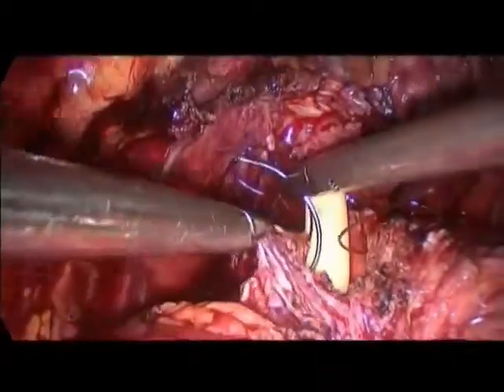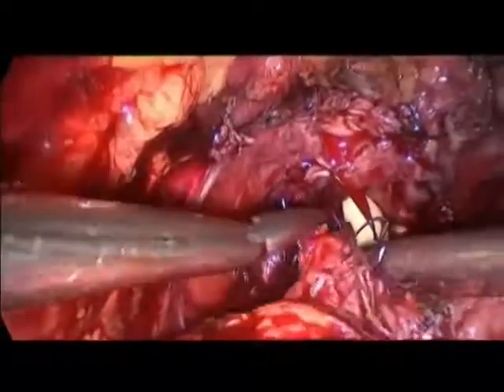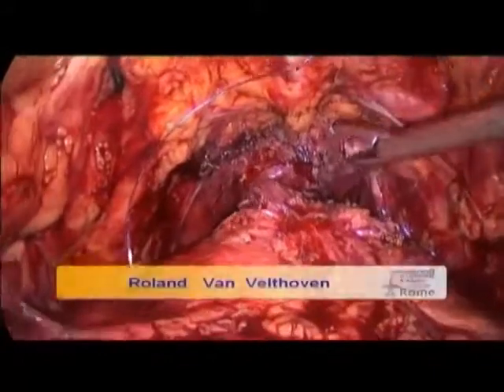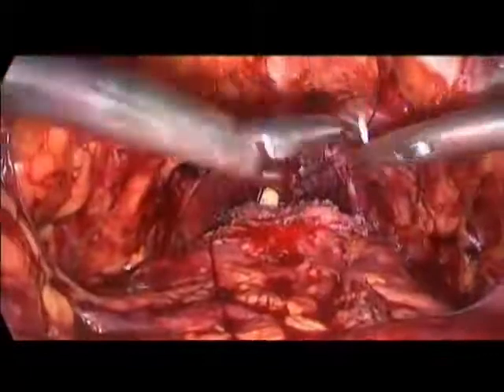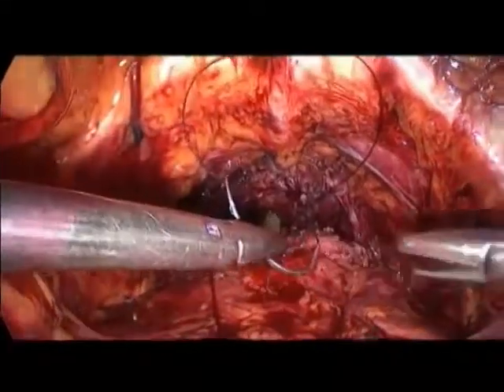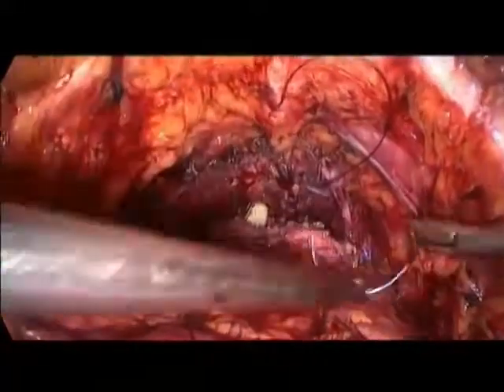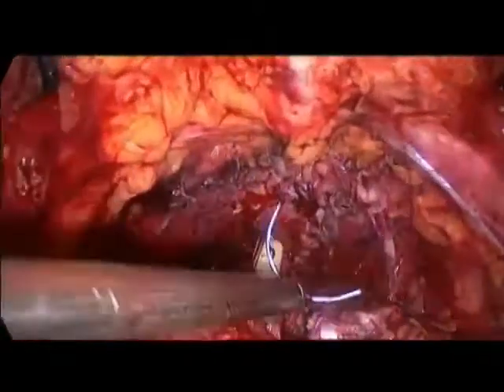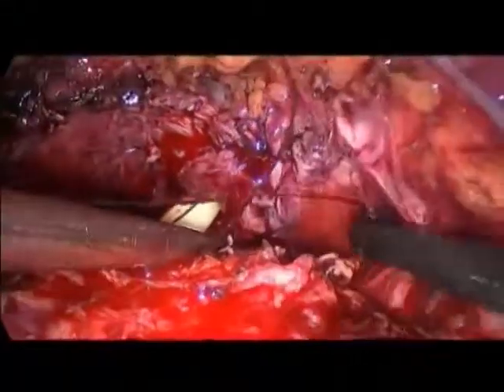And we had some troubleshooting problems with my first suture, so that I had to start from the very beginning again, but this was not a problem. And as you have seen, we have completed the posterior layer, passed the catheter through the anastomosis, and now we are proceeding with the additional stitches at 3 and 9 o'clock. It is already achieved on the left side. We have to place here a stitch inside out at 3 o'clock.